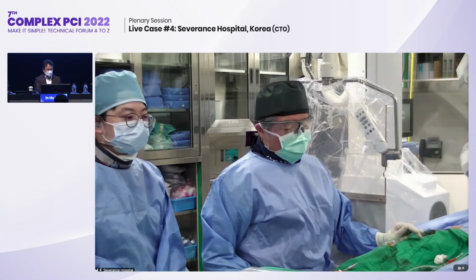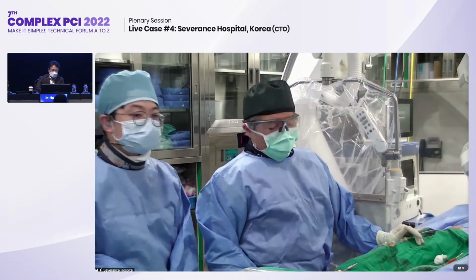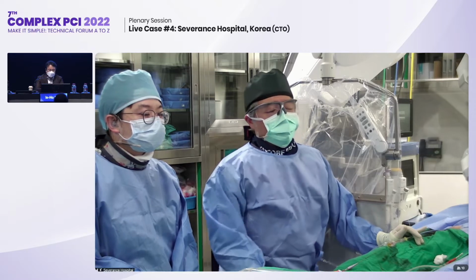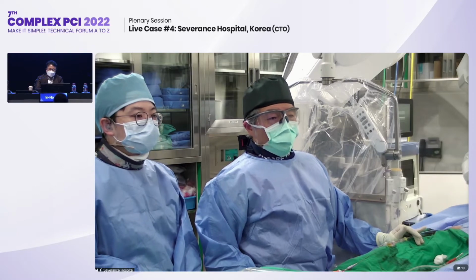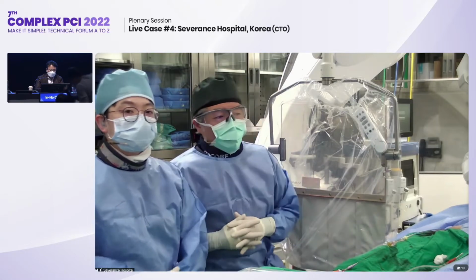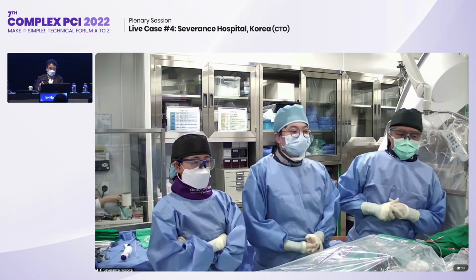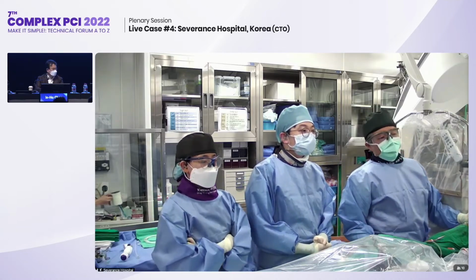Good afternoon, everyone, and moderator, chairman. It's really a great honor to make a live demonstration in our Yonsei classroom. I would especially like to appreciate Professor S.V. Bach and Dogu and the Complex PCI teams. Let me introduce my team. My co-operator, the second operator, is Professor Seung-Jun Lee, and the third operator is Bom Lee. So let me start with our case.